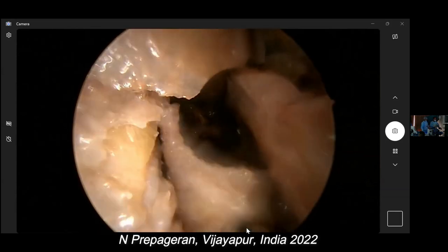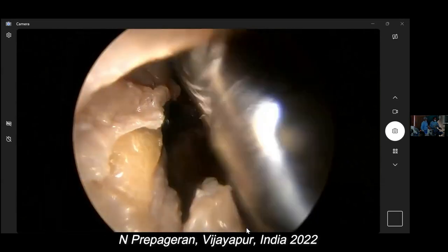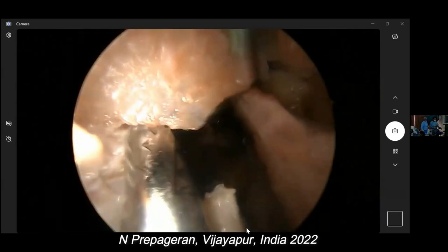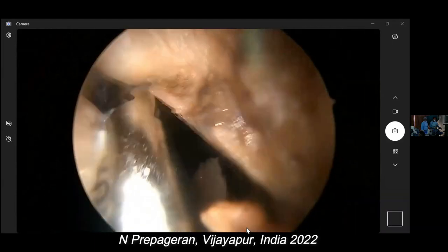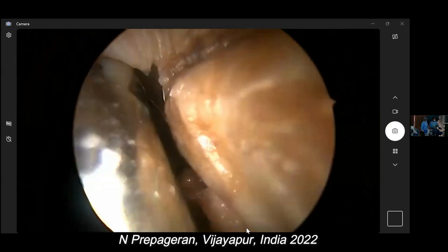So I'm going to remove the anterior part of the inferior turbinate. Right. We remove a little bit of the septum. It keeps coming in our way.